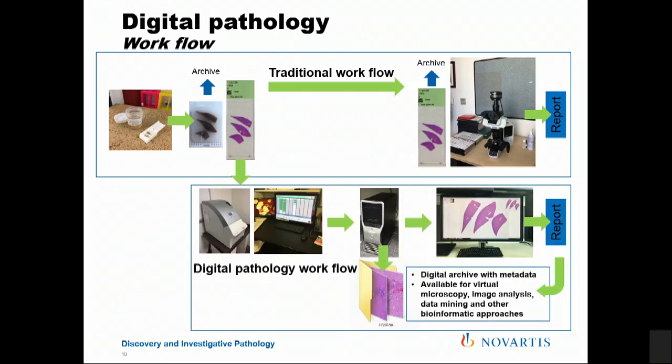In a digital approach, instead of delivering the slides to the pathologist, slides are scanned, and then these scanned images reside in a database along with the associated metadata. And this has several advantages for the pathologist. They can review the slides at their desk, they can take pictures relatively easily. But the big advantage is that these slides can be accessed again relatively easily. The associated data, the metadata, is contained with these slides, and one can apply additional bioinformatic approaches to interrogate the slides.